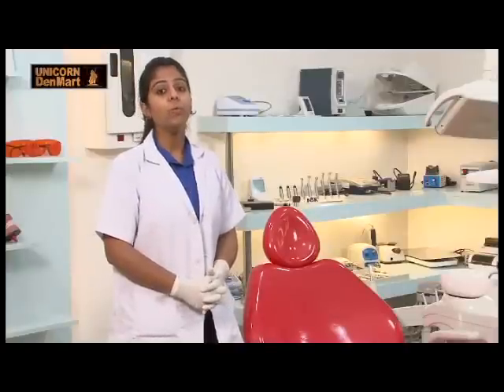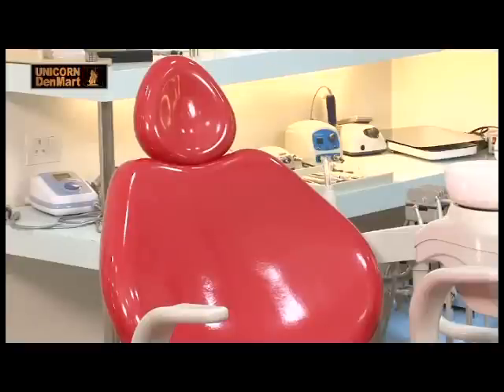This chair has a seamless upholstery which prevents adherence of dust. It also has plastic parts made of GE plastic. Having a double articulated headrest with seesaw movements, it can be customized to treat patients comfortably.